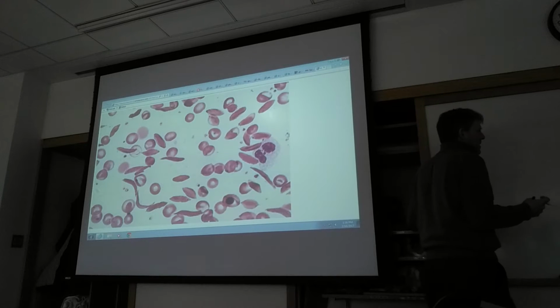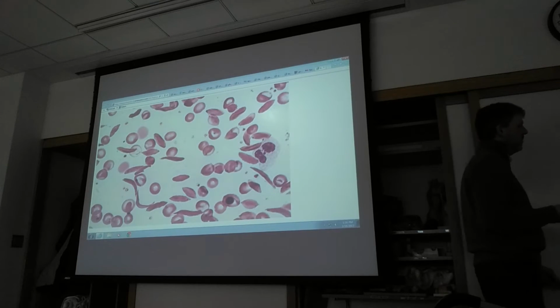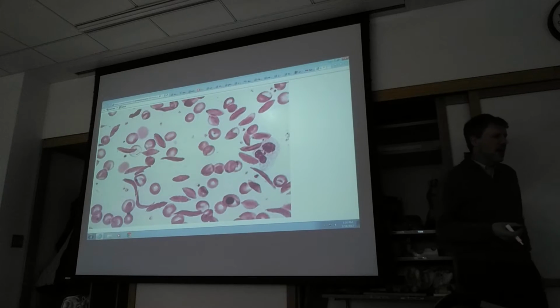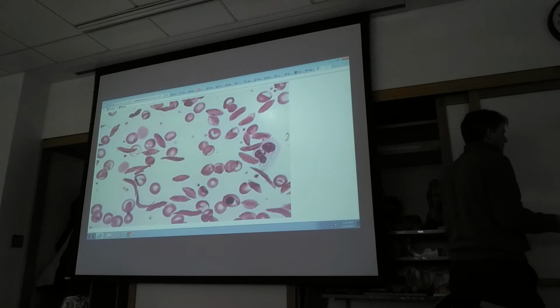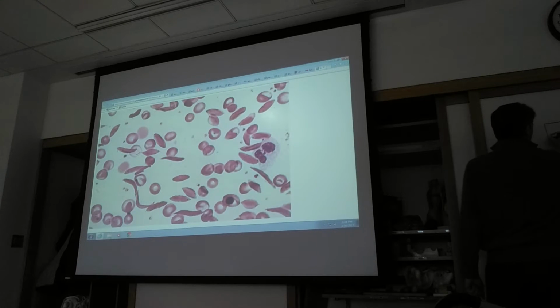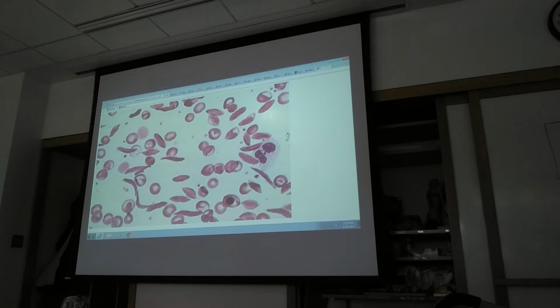Basically, to figure out the blood type of a person, you have to take their blood and test for little antigens that are on the surface of their red blood cells. You take their blood and put it on a little tray that I have. And I'll let you do this. Again, it's fake blood, so don't be like, oh my God, am I going to get some crazy disease? These are what the little trays look like.